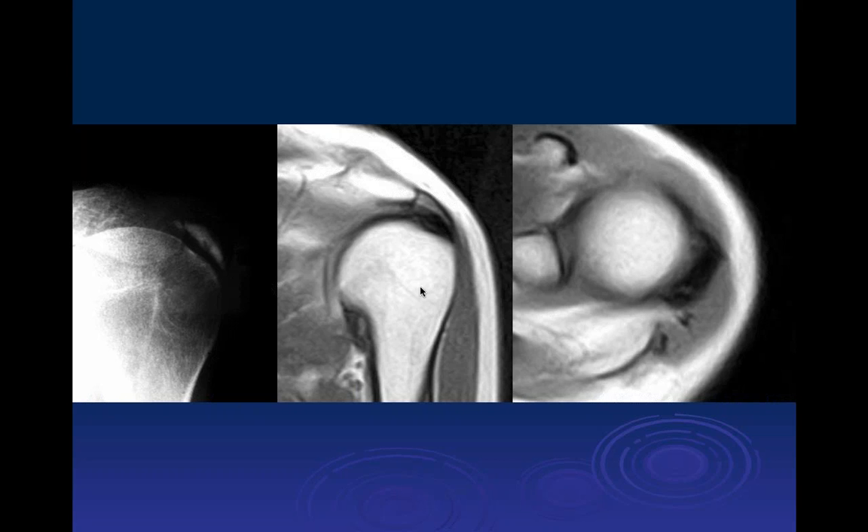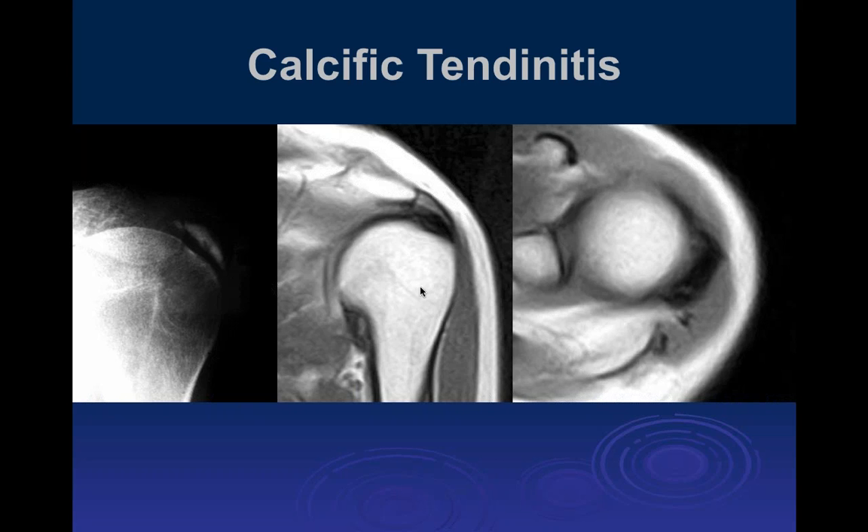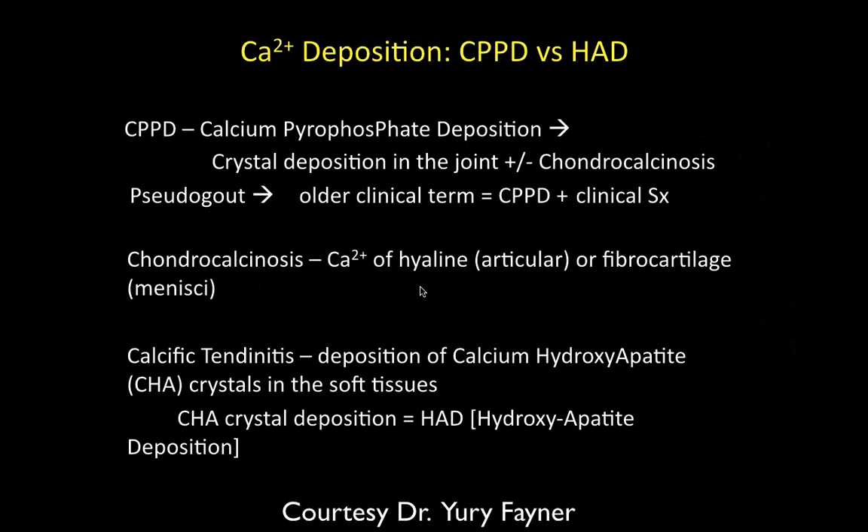How often do you see this without edema? It's more common without edema. When there's no edema, you can call it calcific tendinosis. When there is a lot of edema, you call it calcific tendonitis or calcium associated with a partial tear, depending on what it looks like.